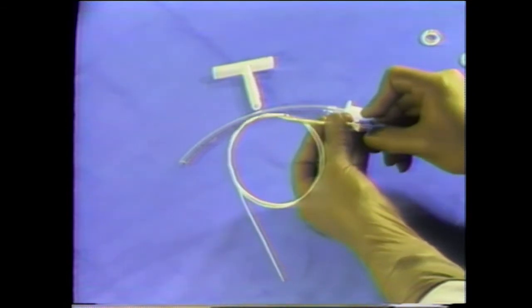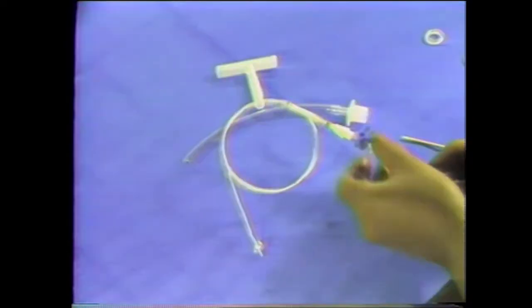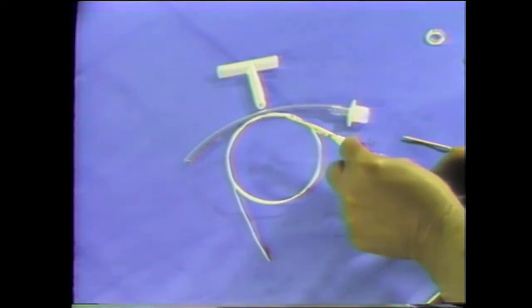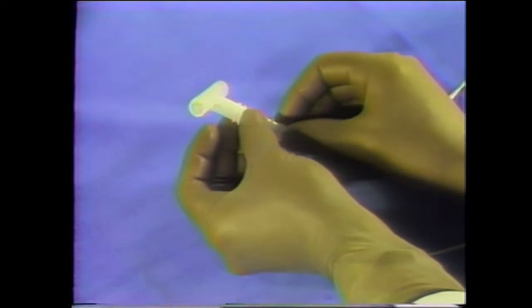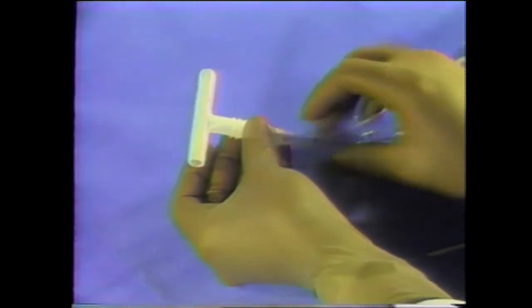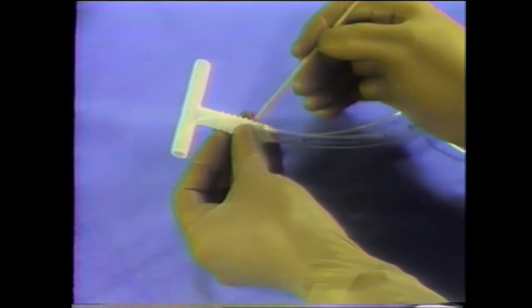To prevent loss of air or anesthesia through the upper intraluminal portion of the safety tube a closed system can be created. The three-way stopcock is attached to a Fogarty type catheter and then to the syringe. The stopcock is positioned so that the air will pass from the syringe to the balloon at the end of the catheter. It is then adjusted so that air will remain inside the balloon when the syringe is released. The catheter is introduced into the upper intraluminal limb of the safety tube and inflated. The endotracheal tube is inserted into the extraluminal portion of the safety tube and connected to anesthesia tubing, which is passed off to the anesthesiologist who will now have a closed system with the distal trachea and lungs.